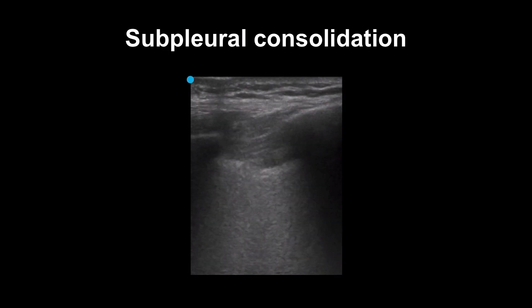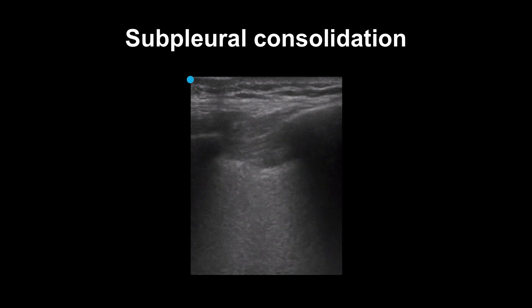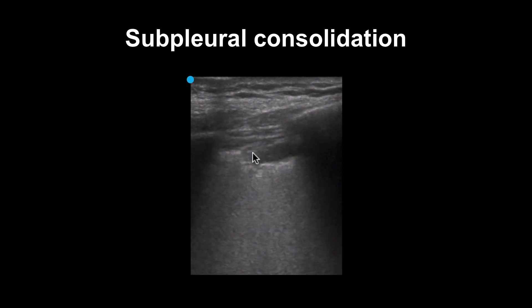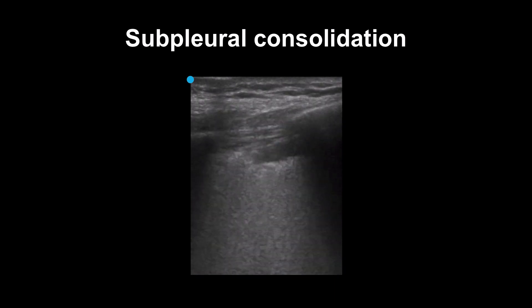You will occasionally see lung abnormalities in a pulmonary embolism. This is an example of a subpleural consolidation. Remember that ultrasound findings can be nonspecific. We can see this small subpleural consolidation here, and the patient was ultimately diagnosed with a pulmonary embolism. This subpleural consolidation corresponded to a lung infarct seen on their CT scan.